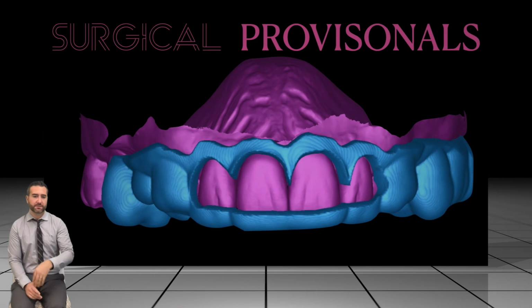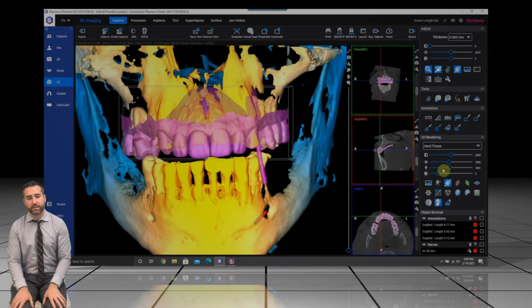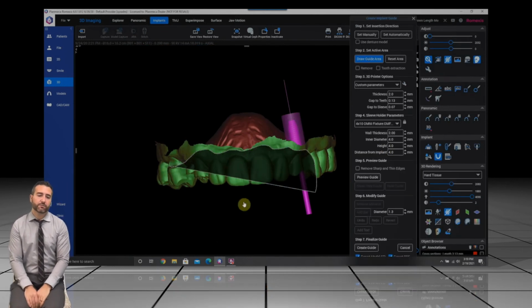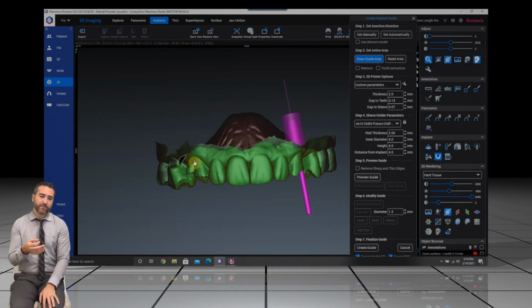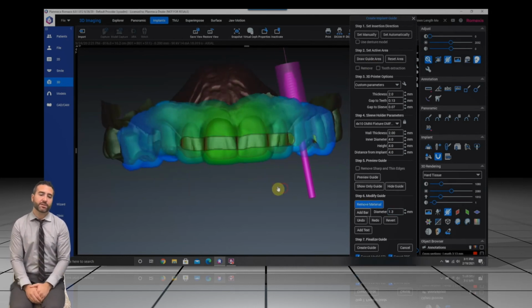And this guide not only is for an implant that we're going to place, but it's also for the soft tissue removal and for the hard tissue removal. So we snap this on the day of surgery, and that's going to guide our soft tissue removal. And this was all designed with, of course, CBCT, and then using surgical guide software, we're able to design this and measure out 3 millimeters for osseous removal after we do our soft tissue removal here, which is based off of our diagnostic wax up that the patient approved.